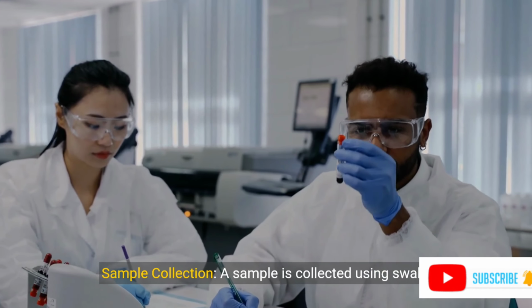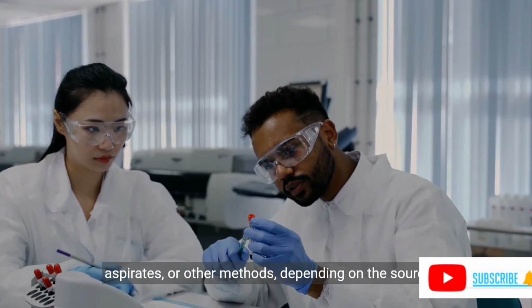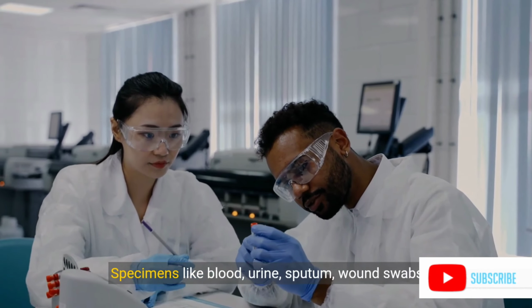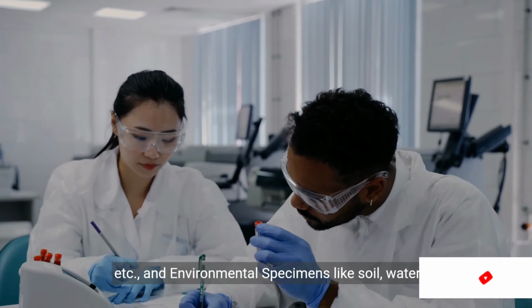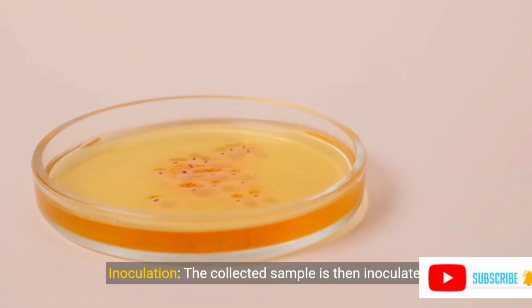Sample collection. A sample is collected using swabs, aspirates, or other methods, depending on the source of the specimen. Common sources for samples include clinical specimens like blood, urine, sputum, wound swabs, etc., and environmental specimens like soil, water, air, food products, etc. Inoculation.